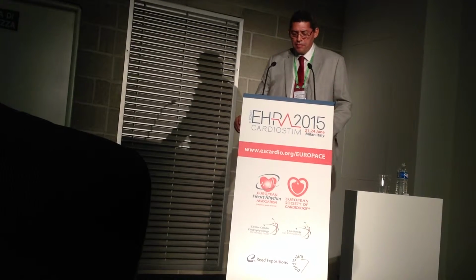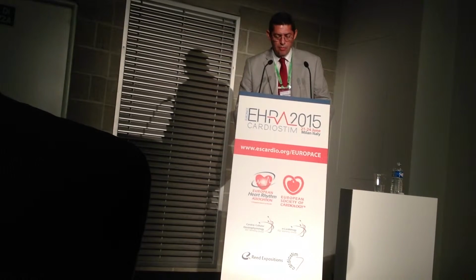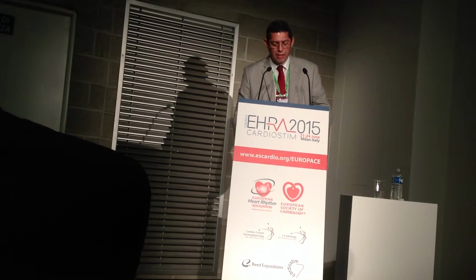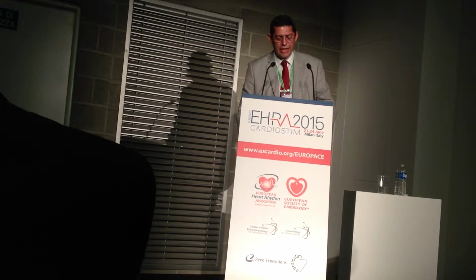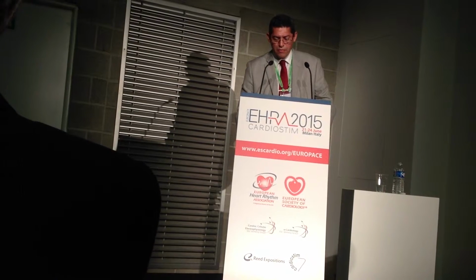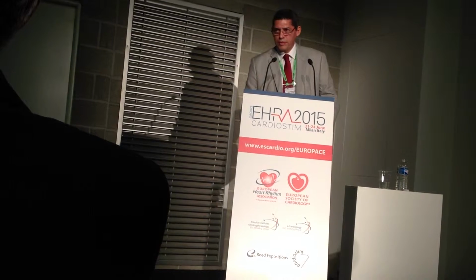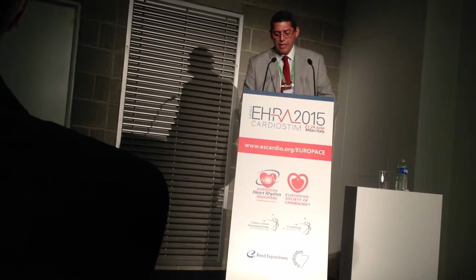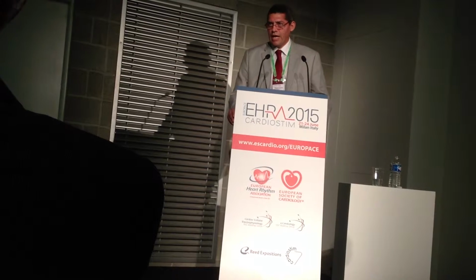Or the isochronal map can be useful in patients with V3 transition and septal early activation. Both isochronal maps were performed in the RVOT, but if the isochronal map had this morphology with small area, the arrhythmia origin was in the RVOT. On the other hand, if the isochronal map had this morphology with a longer perpendicular axis and an area more than 2.3 square centimeters, the arrhythmia origin was in the LVOT. This important information can be useful to avoid extensive ablations in the RVOT.